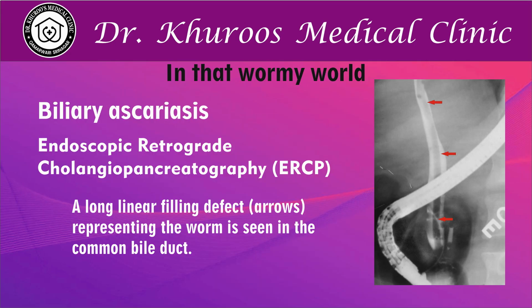An ERCP was done in this patient because of severe intractable biliary pain and severe cholangitis. The cholangiogram revealed a long linear filling defect in the bile duct, which was caused by the worm in the duct. At ERCP, we envisaged extracting the worm from the bile duct.